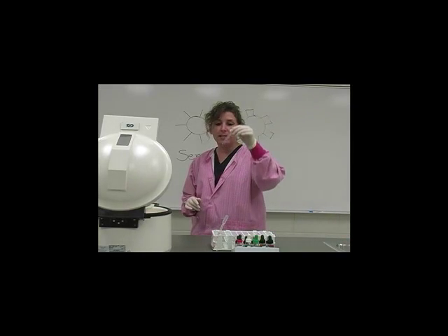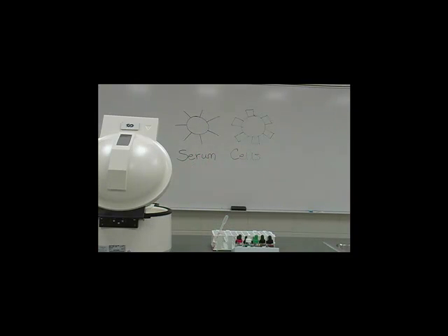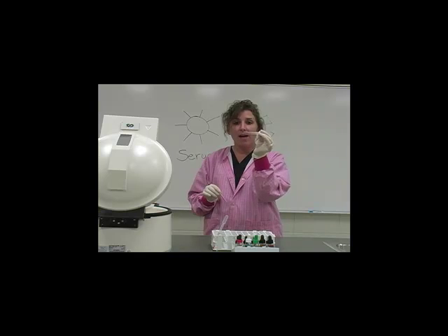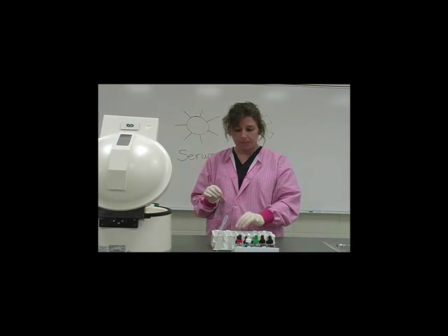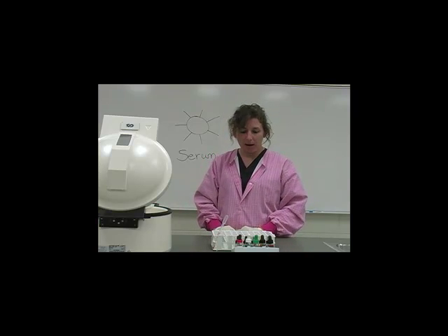And again in our D tube, you can see it is depicted by a clot. So what this actually simulates is that we have an A positive patient. And this was my blood, so I know that we're correct because I am A positive.